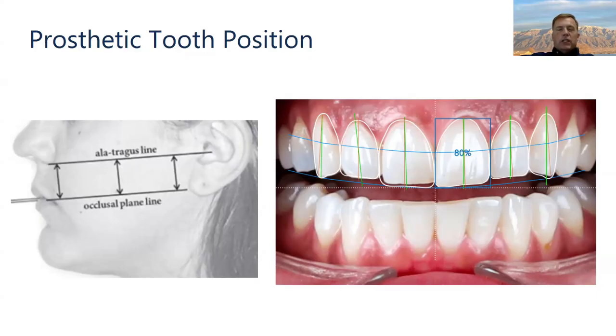As you guys know, especially let's say for a full mouth case, the ideal tooth position and contour begins with the incisal edges of 8 and 9. For most patients, and this can vary a little bit, we want to see 1 to 2 millimeters of incisal edge display with the lip at rest. We want to make sure that the incisal edges don't interfere with the arc of lip closure, and that we get good phonetics, especially if they say a or when they're using a really soft F and V.